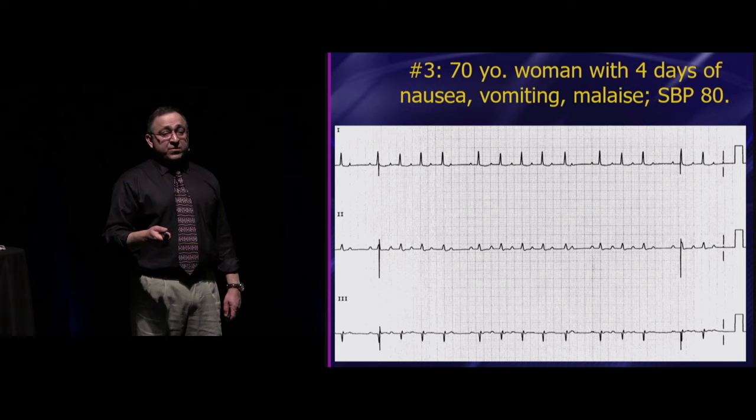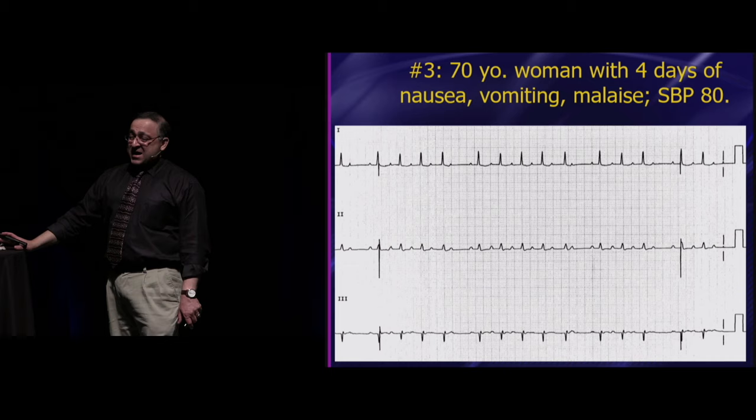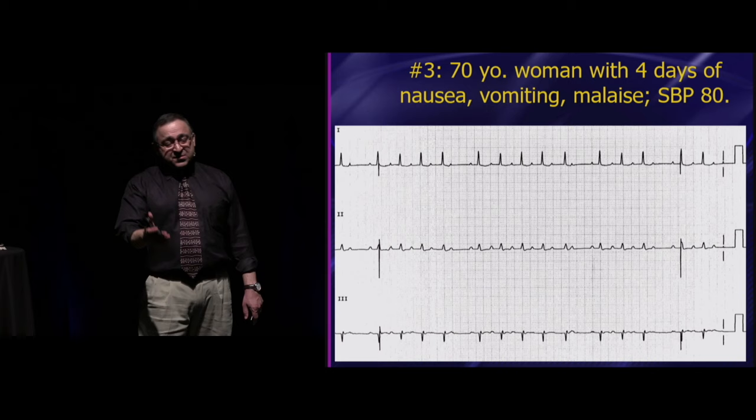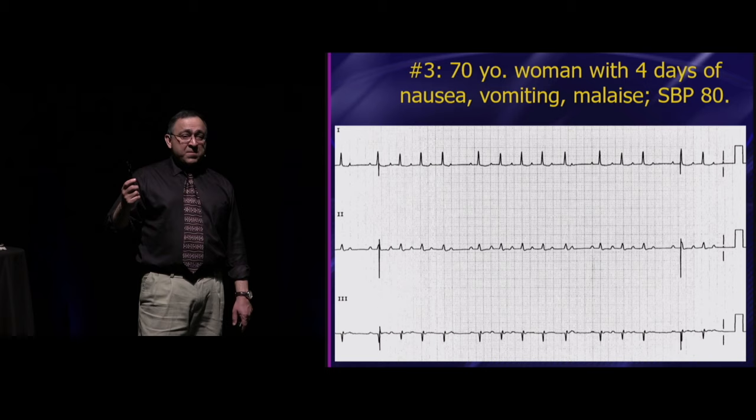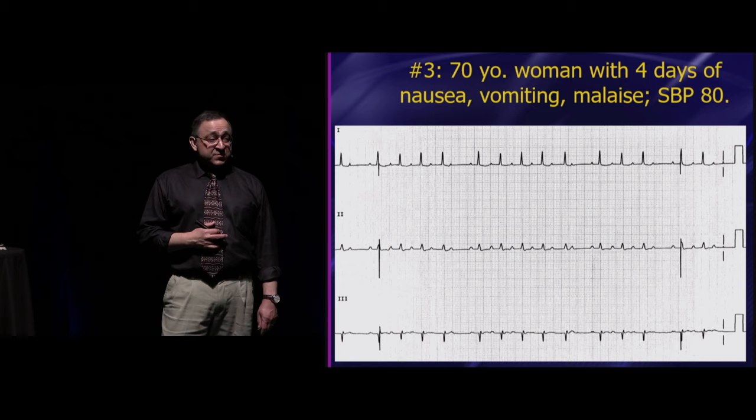All right? So this is a scenario where the patient's got a Mobitz 1, but with the ventricular rate 94, it's not causing the hypotension. So this is a person that you just want to give fluids. And also Mobitz 1, a lot of people live in Mobitz 1. If there's people in this audience, I'm sure there's a few that run marathons, do triathlons, things like that, it's very possible that you live in a Mobitz 1. And it's totally normal. It's just if you have high vagal tone, you may live with a Mobitz 1. You'd probably have a lower heart rate than this, though.